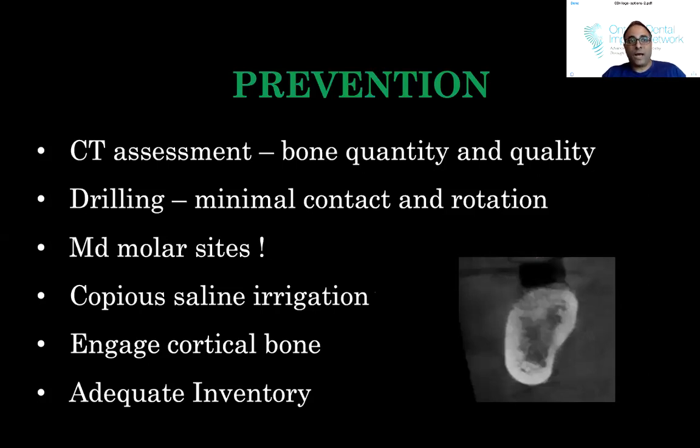If you feel like you have lost stability, then if there's cortical bone, engage the cortical bone, right? Cortical bone meaning floor of the nose, floor of the sinus, and if you have the proper length, which is why I use a lot of long implants. I try to get that cortical bone. And of course, you need to have adequate inventory because if you need to go wider or longer, then you need to have that adequate inventory.